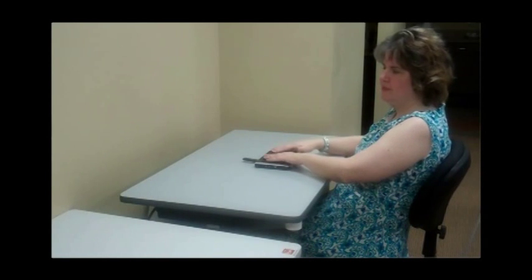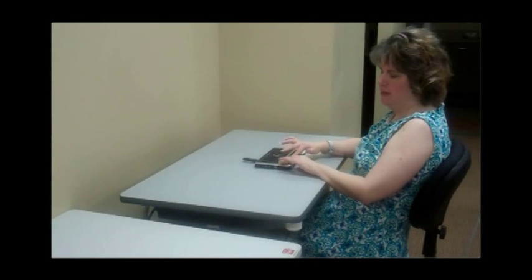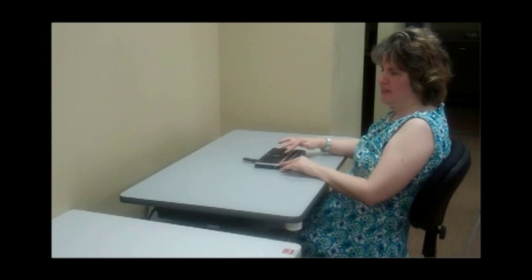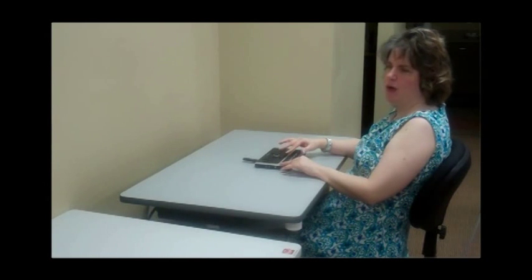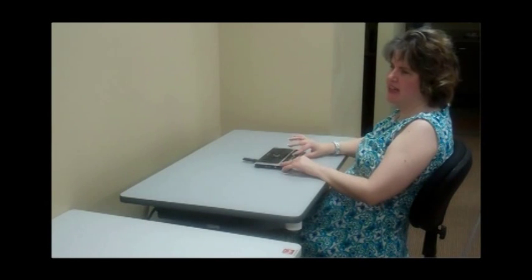Options. And then it comes up and asks me if I want to review the options. Basically, I'm going to bypass all that. It just wants to know if I want to read it in Braille, and I do. Oh, this is a text document. Computer Braille is required. Top of document. Center line. And then it tells me right where I am, in case I needed to know that the text at the top of the page is centered, and it tells me that it's a text document.